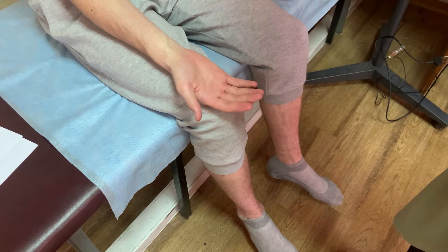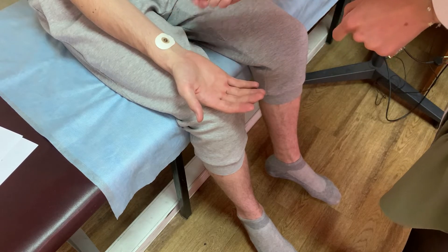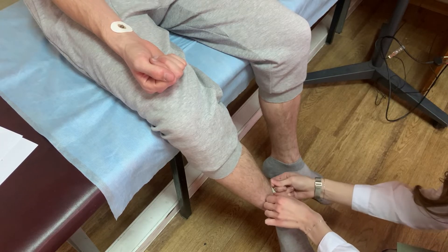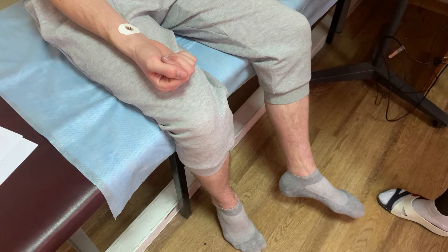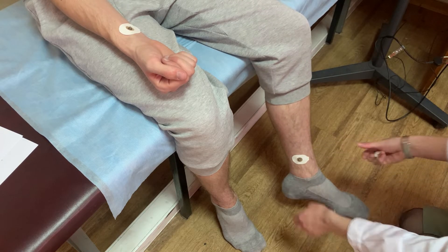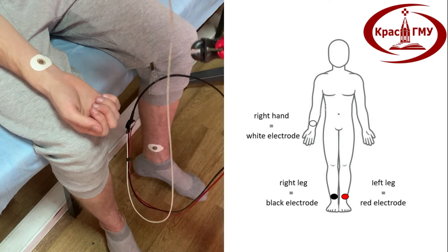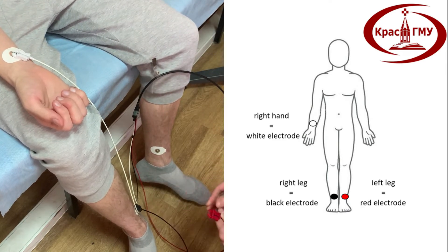Place one electrode on the right forearm just above the wrist, one on the inside of the right leg just above the ankle, and one on the inside of the left leg just above the ankle. Insert the lead electrodes into the electrodes, paying attention to color coding: right forearm — white electrode; right leg — black ground; left leg — red electrode.